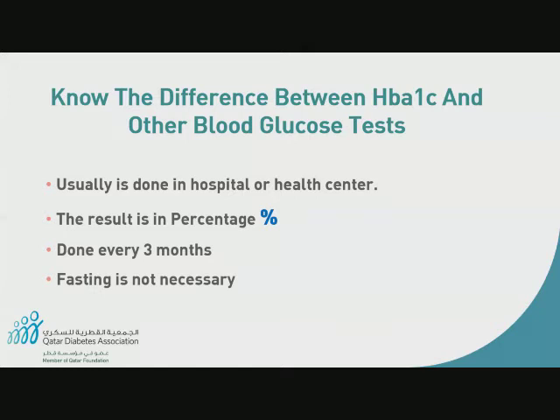It's used everywhere you go. Although sometimes the result might get affected if you have some blood problems, like problems with hemoglobin, or deficiency of vitamin B12 or iron, but still it's reliable, and it's done on a regular basis.